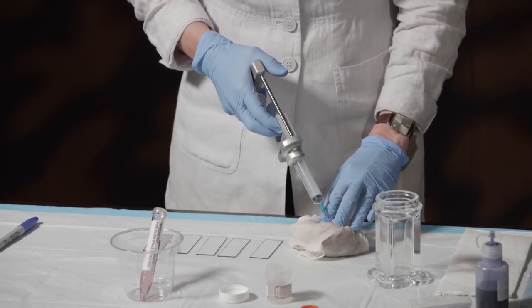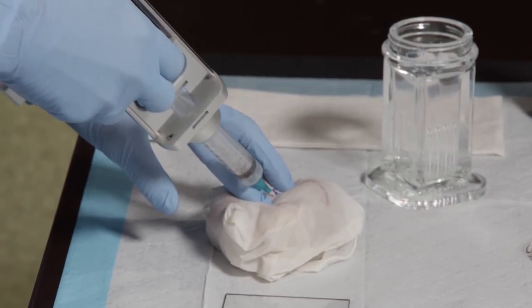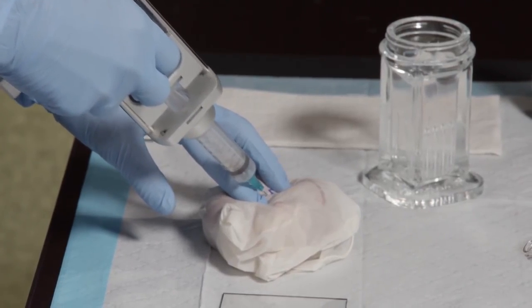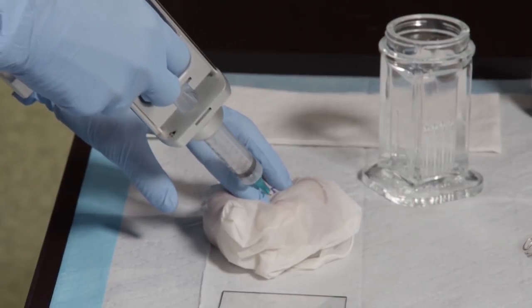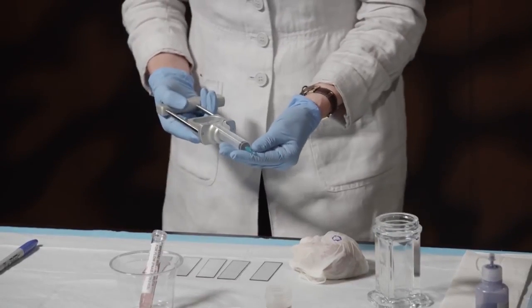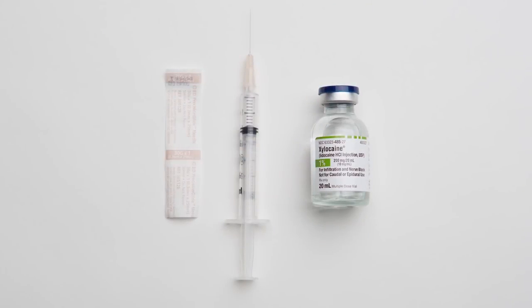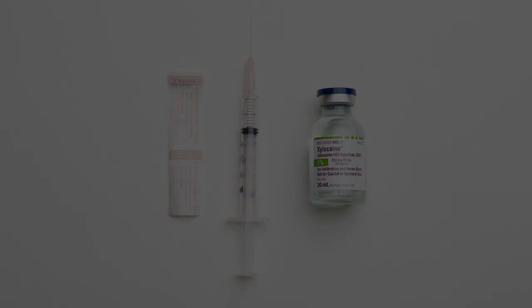When using suction during sampling, about 1 milliliter of vacuum applied by pulling back the plunger is sufficient. Maintain the suction throughout sampling and release after sampling is complete and before pulling out the needle. Local anesthetic without epinephrine applied with a 30-gauge needle attached to a 3 milliliter syringe provides optimal patient comfort.